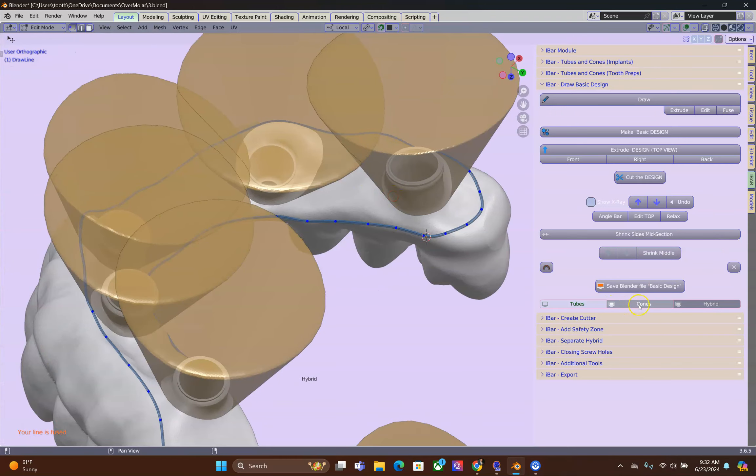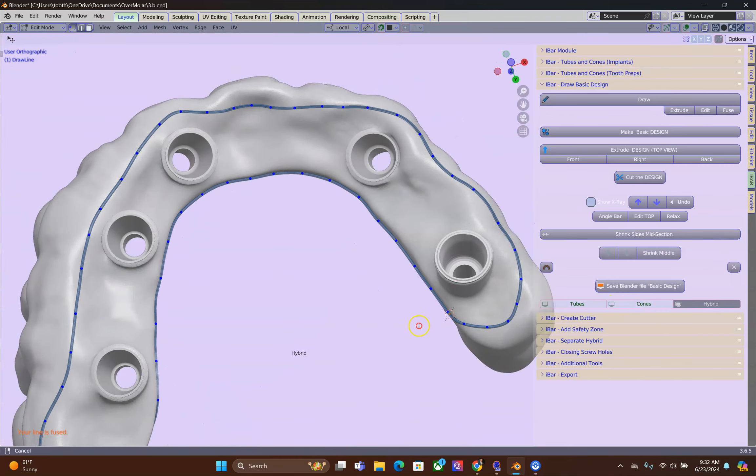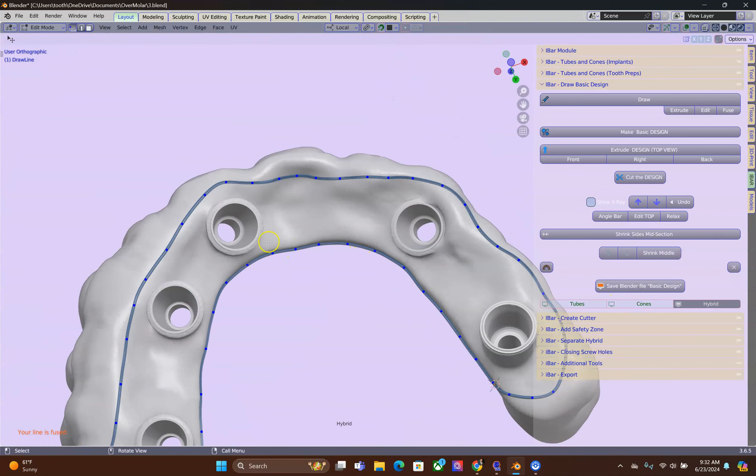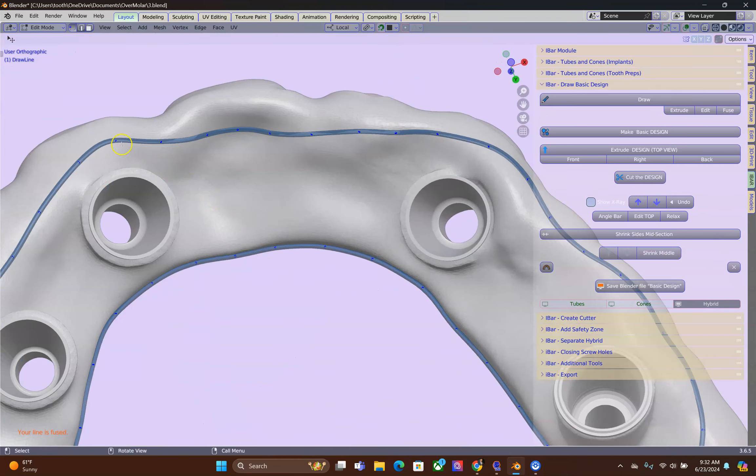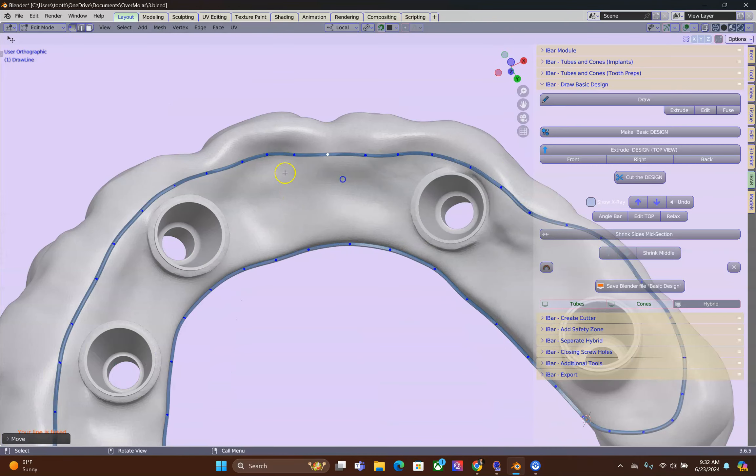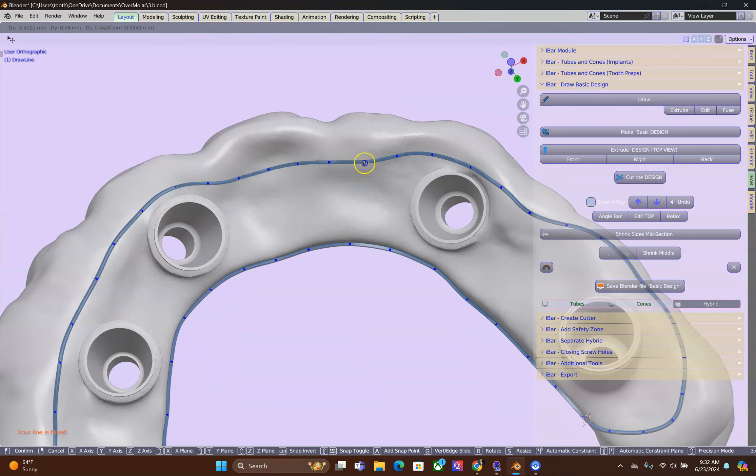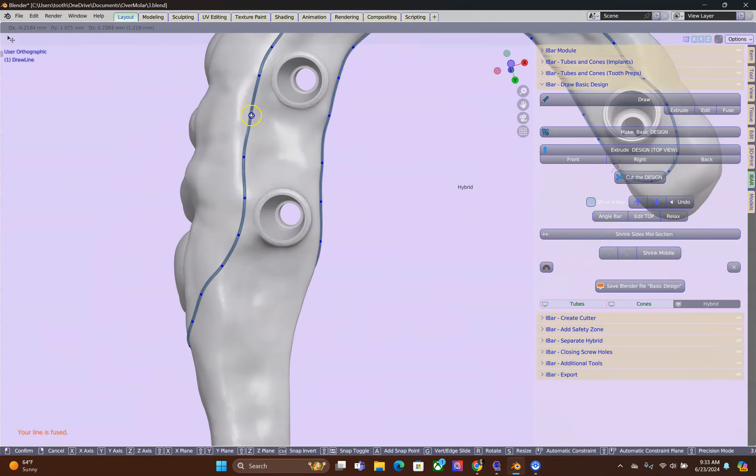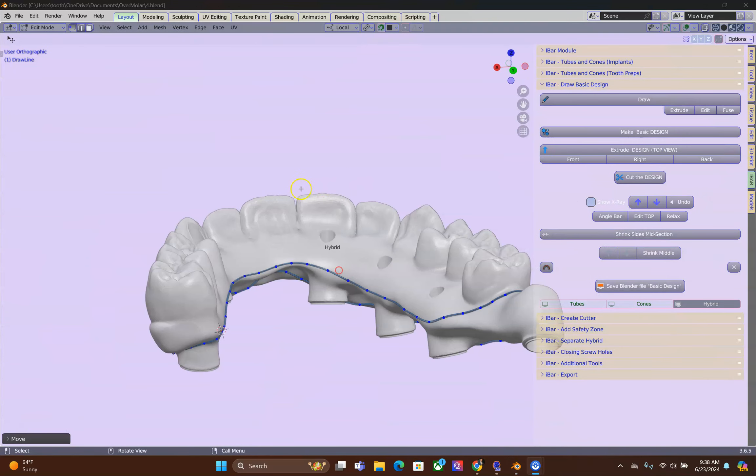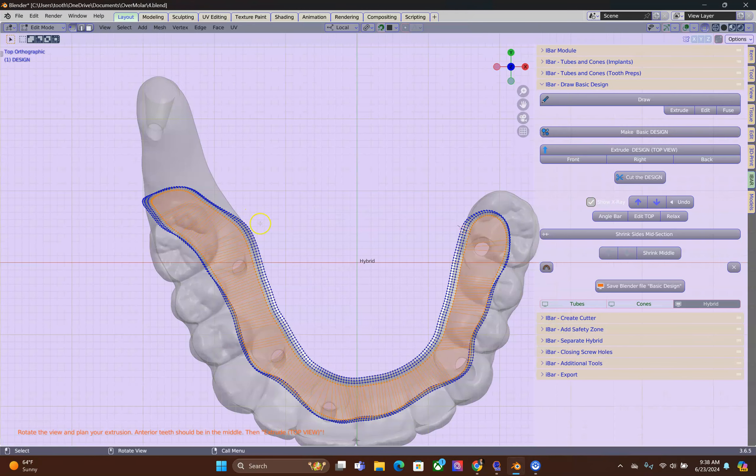I'm going to hide the cones and I'm going to edit the lines a little bit. We're going to make the basic design.